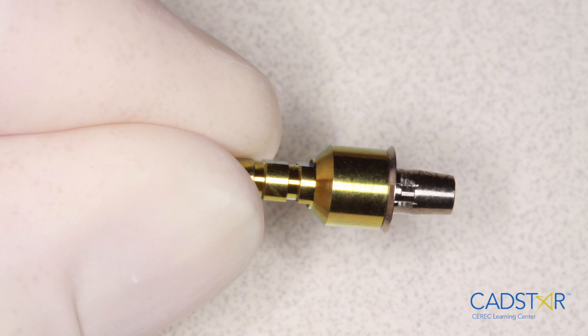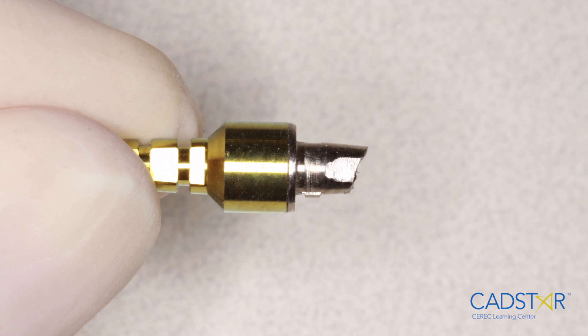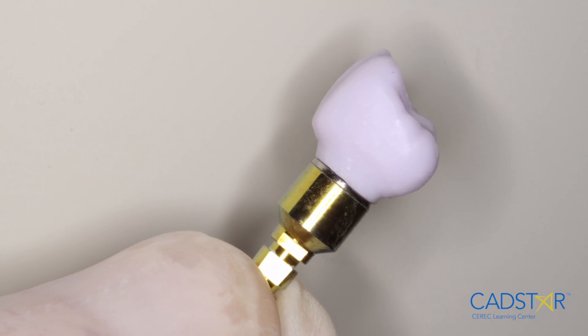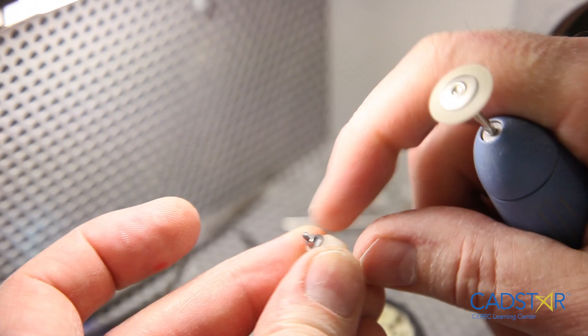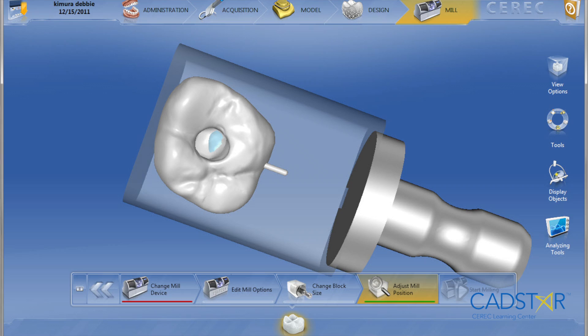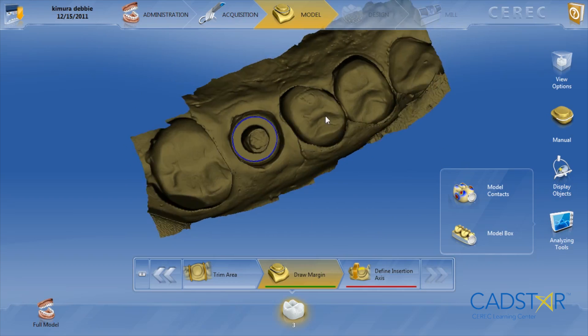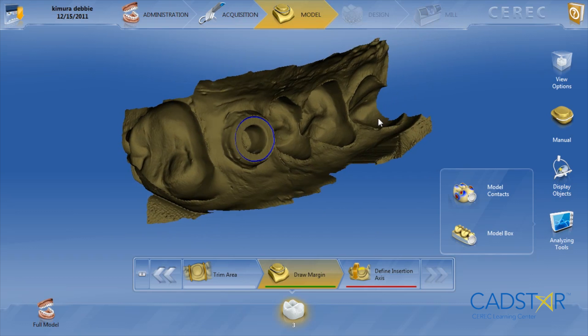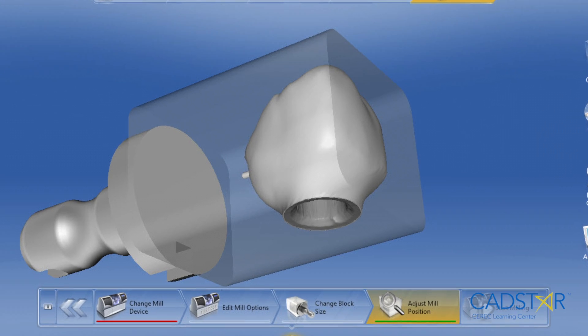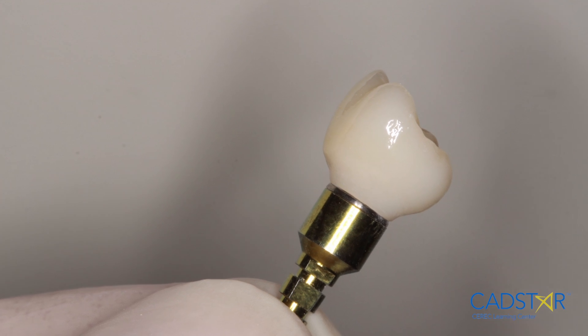As CEREC users, we're very creative — at least I am. I want to share what I've done in my CEREC Clinical Theater to adapt. I order the tie bases, but I manage my own abutments and my crowns using Emacs. As long as I have a screw retentive angle where I can use screw retentive access within my crown, I'm scanning in the tie base, designing my own emergence, and making a solid abutment crown implant.